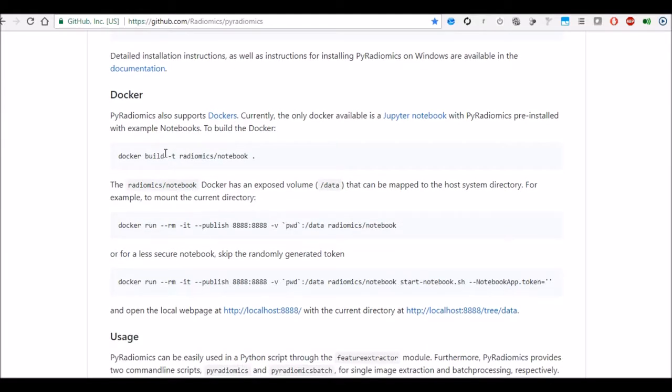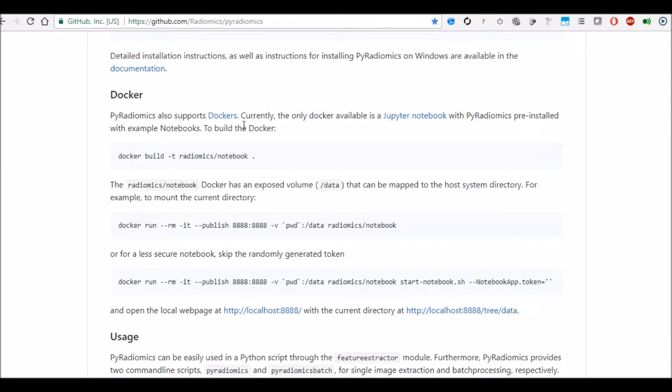So docker is like a virtual platform container which is really good because it lets you move your whole application from one machine to another. So pyradiomics is supporting docker and currently they have jupyter notebook which is a docker environment which has pre-built pyradiomics pre-installed into it.